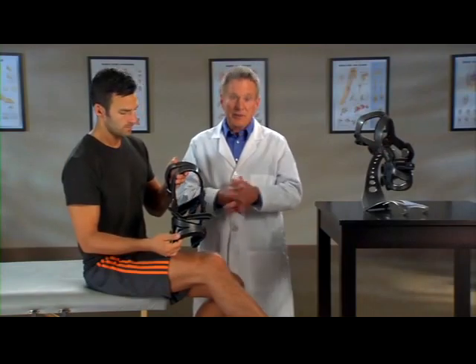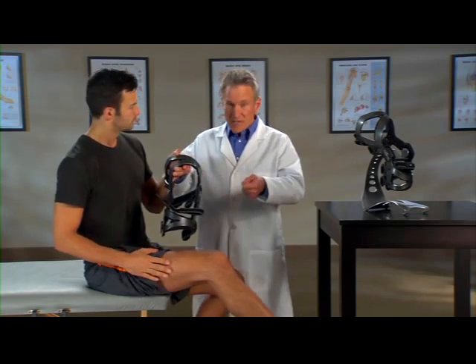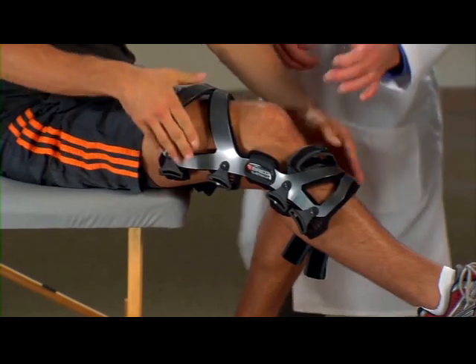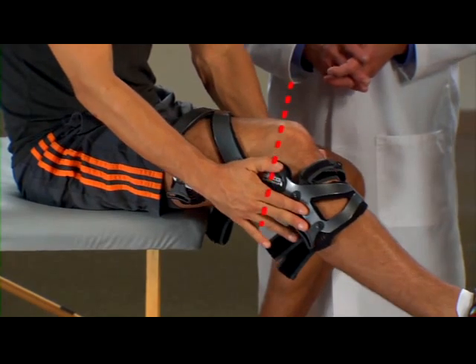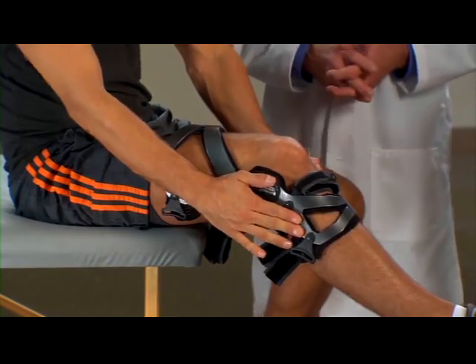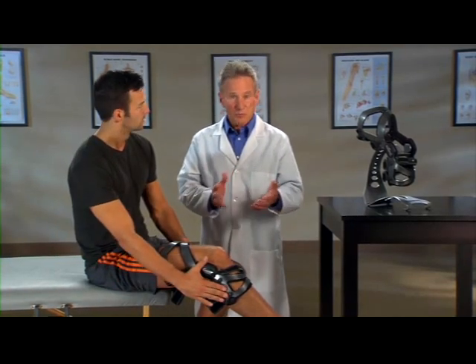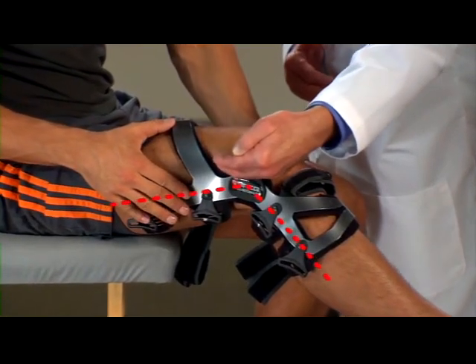Sit with your knee bent at a 30-degree angle in a gas pedal position. With the brace fully extended, slide it down onto your leg. Position the brace so the center of the hinges aligns with the top of your kneecap. The hinges may be positioned behind your bent knee — this is normal. As you fasten each strap, the hinges will move forward until the brace is properly positioned on the leg, slightly behind the midline of your knee.